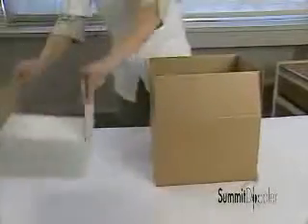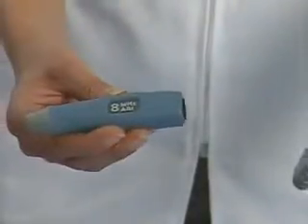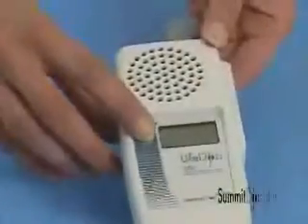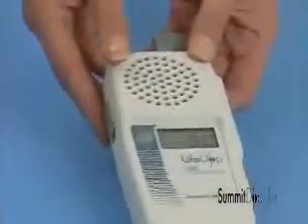Setting up the system is simple. Remove the Doppler and the printer from their packaging. Plug the coiled cable into both the probe and the Doppler main unit. Press the button to turn the Doppler on and off, and use the slider to adjust the audio volume.